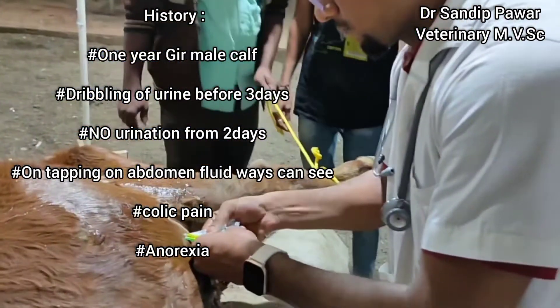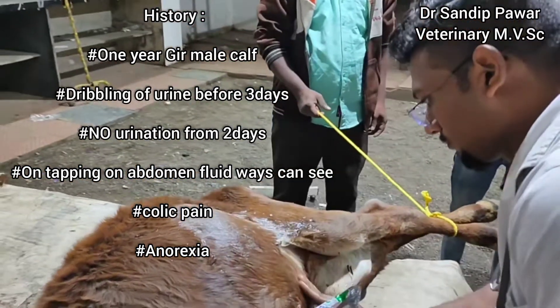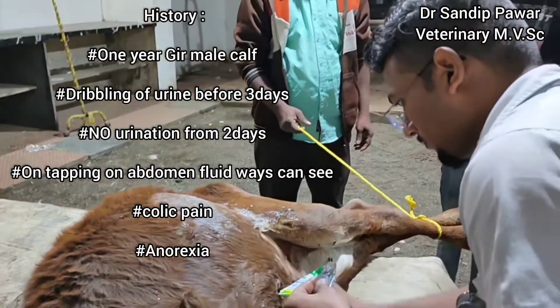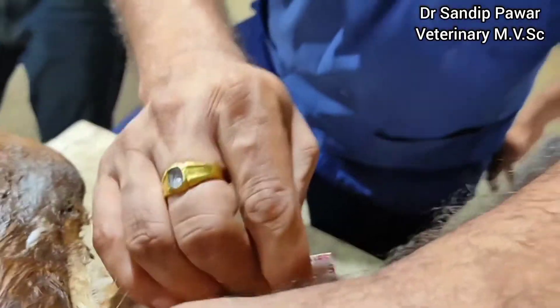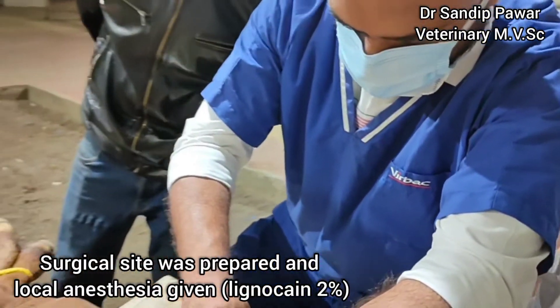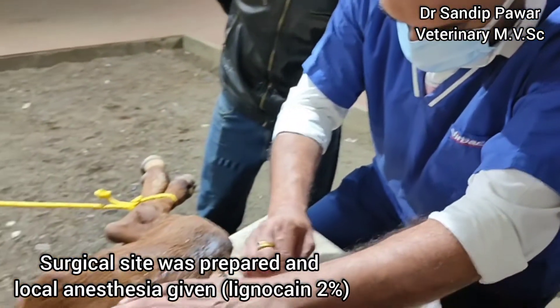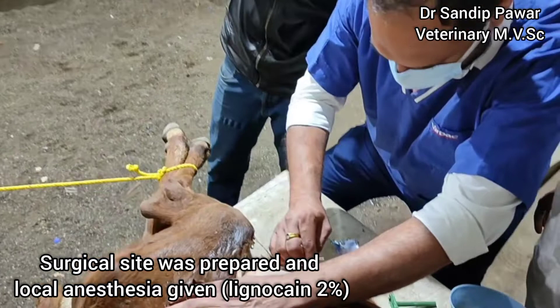On the screen you can see the signs and symptoms observed in this calf. On paracentesis, it was observed that there is a rupture of the urinary bladder.